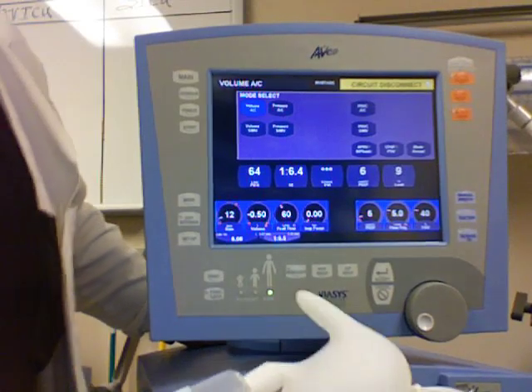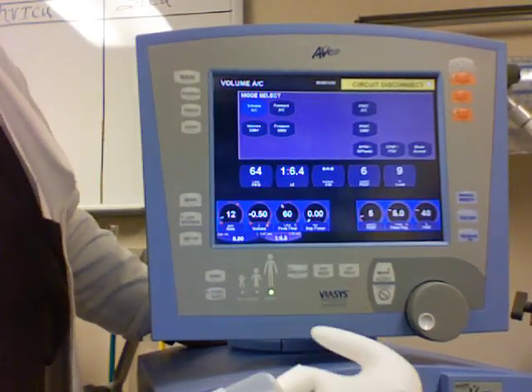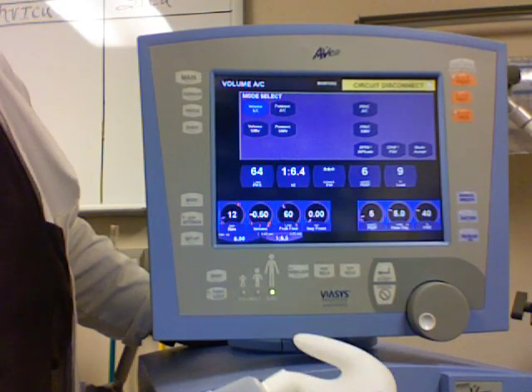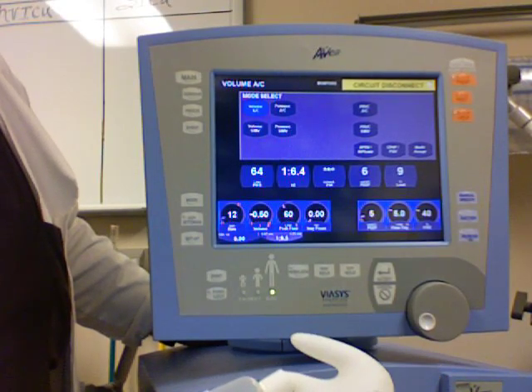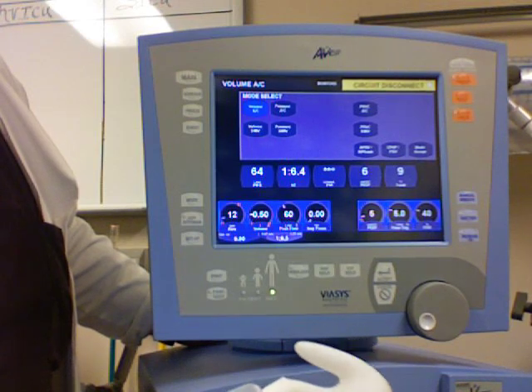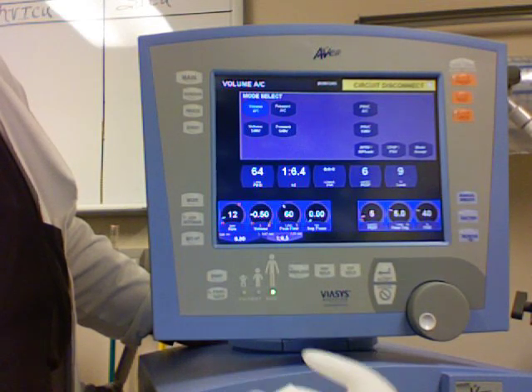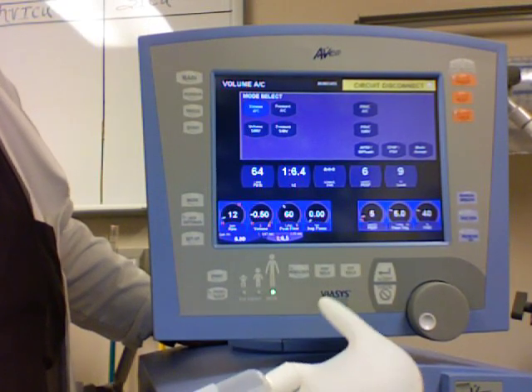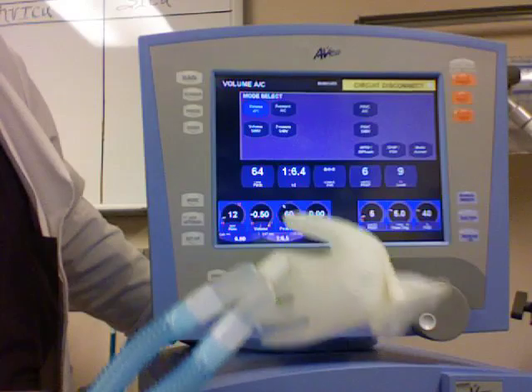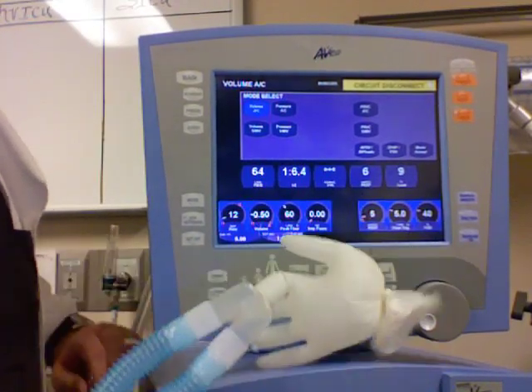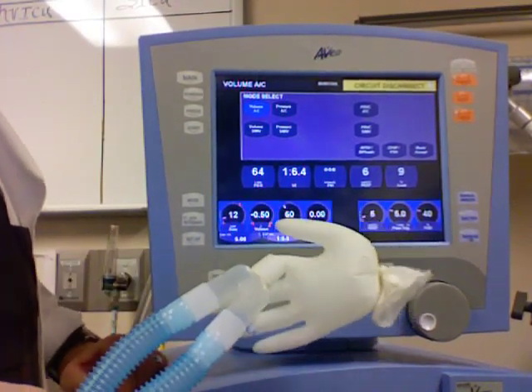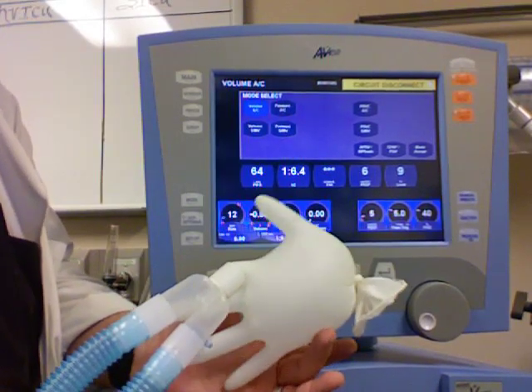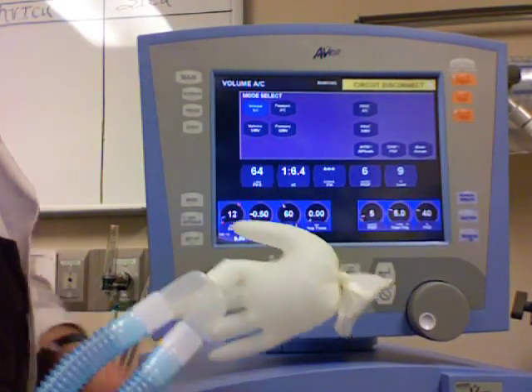Typically they might go by 10 milliliters per kilo of body weight. So if you have a 70 kilogram man, then 70 kilos is his ideal body weight, and you might pick 700 cc tidal volume. Right now this ventilator is set on 500, so the breath is over when 500 has been delivered to this system, and then it lets it escape.